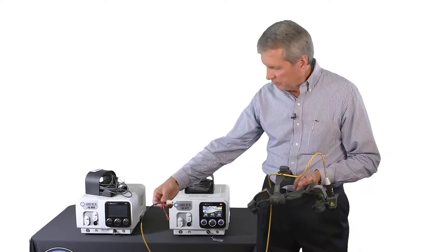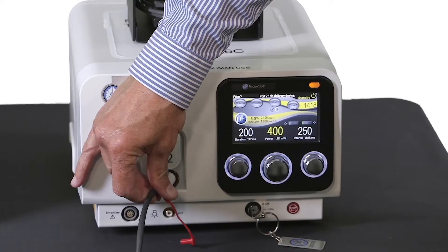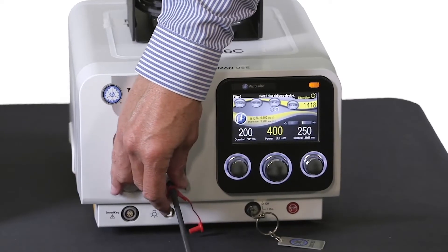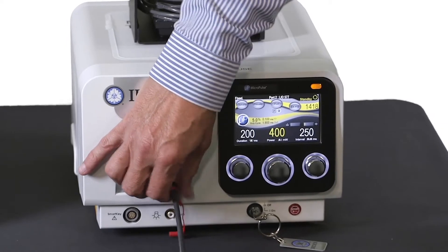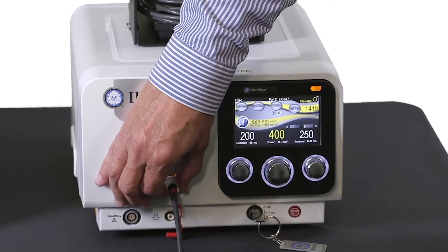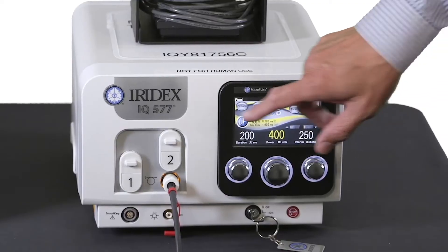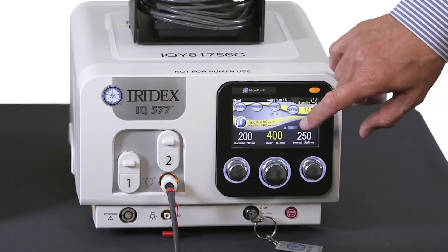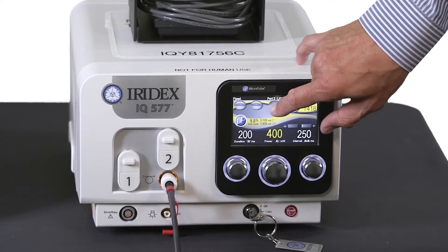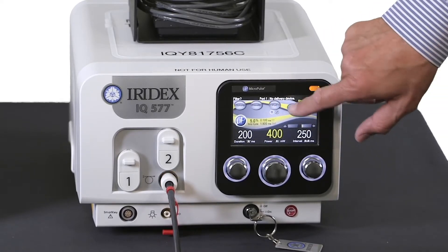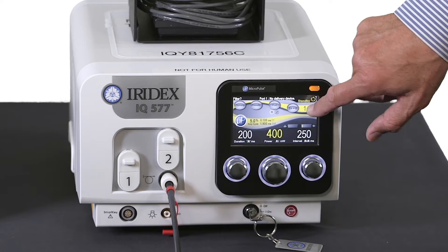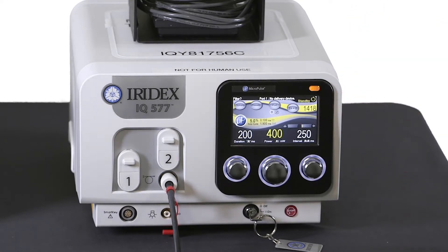Line up the fiber in the middle of the port. Push in, thread it on, and when you feel resistance, stop. At that point, the laser should recognize the indirect. If it's only recognizing port number one, you can touch the port button on top of the screen, and it'll go to port number two, and it should recognize the laser indirect ophthalmoscope at that point.